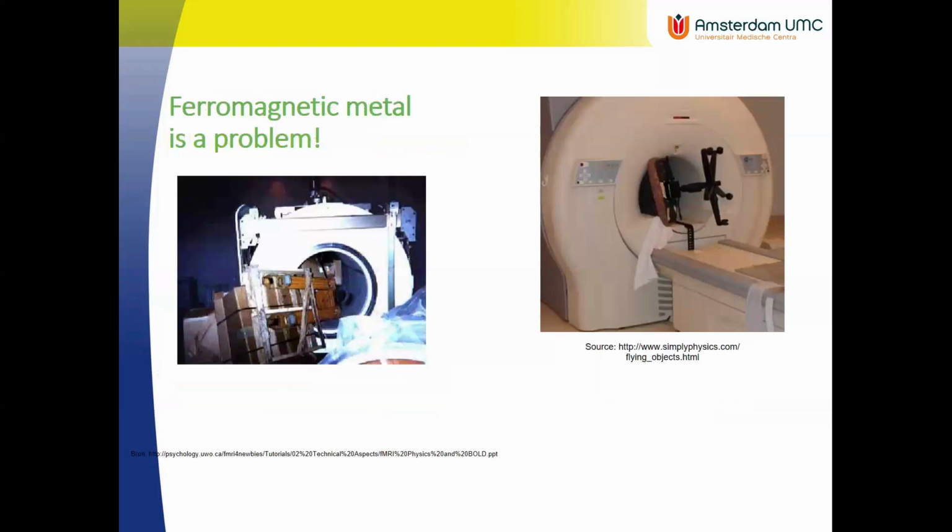The strong magnetic field is a serious security hazard. If you Google MRI accidents, you will find a lot of hits, topics, images, and maybe also filmed accidents, like scissors flying in the scanner.